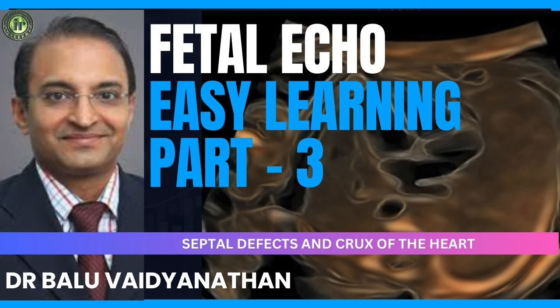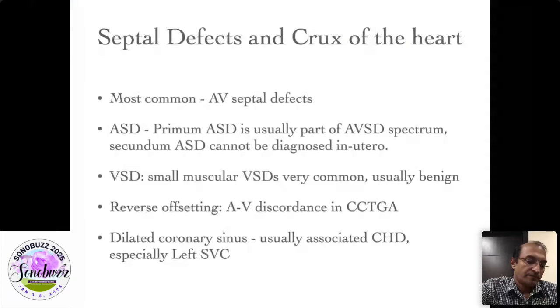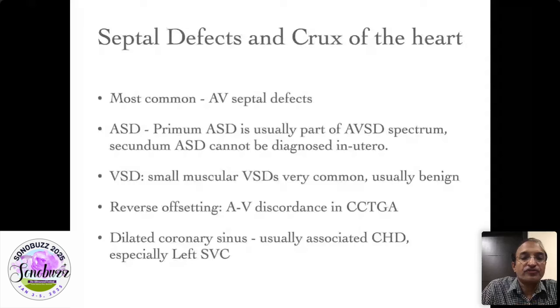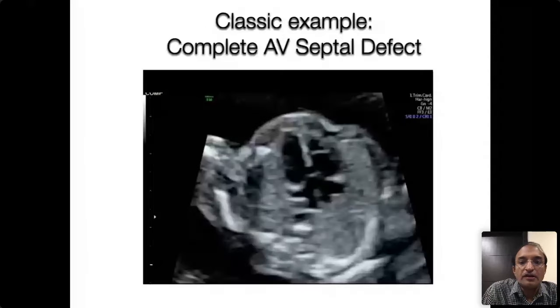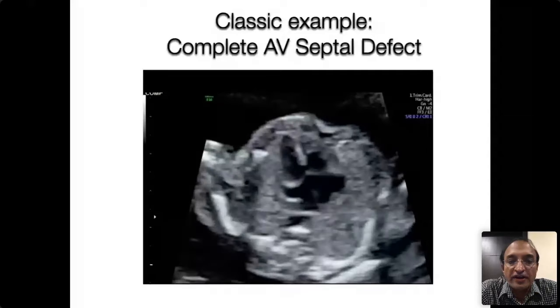The final group in the four-chamber view is the septal defects and the crux of the heart. I'm mostly going to focus on the AV septal defect and also show you CC-TGA four-chamber view, because it very deceptively looks normal. This is an example of a complete AV septal defect — when you look at the center portion of the heart you can make out the defect.